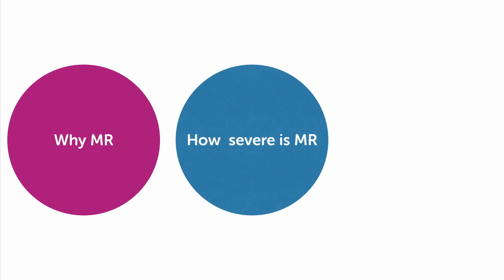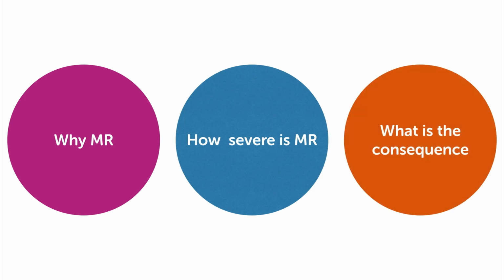Okay, so now it's time to learn something new. We'll cover why patients have MR in the first place, how severe mitral regurgitation is, and what the consequence of our diagnosis is. Let's start with a short case.